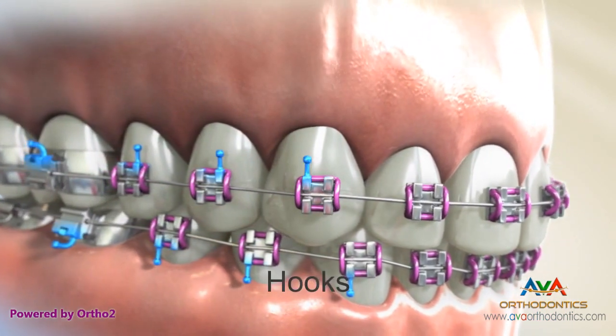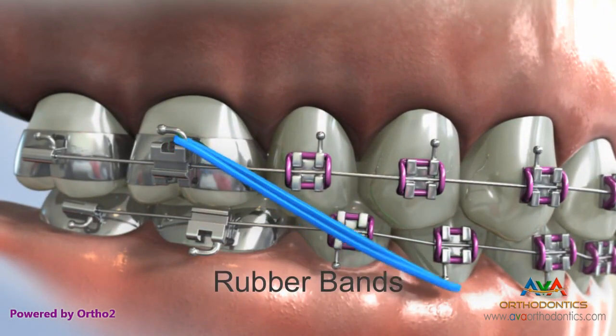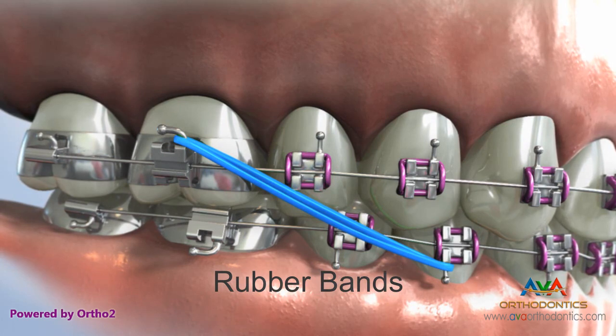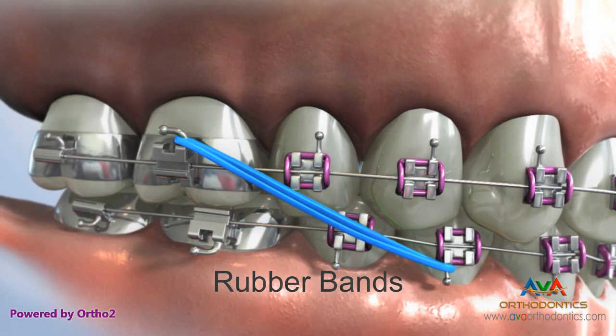Hooks are posts on the brackets that are used for attaching springs, chains, and rubber bands. Rubber bands are often colorful elastic bands that are placed by the patient to apply additional force in order to bring the teeth into correct alignment. They are usually connected to hooks found on brackets. If your orthodontist prescribes rubber bands, be sure to follow their instructions.